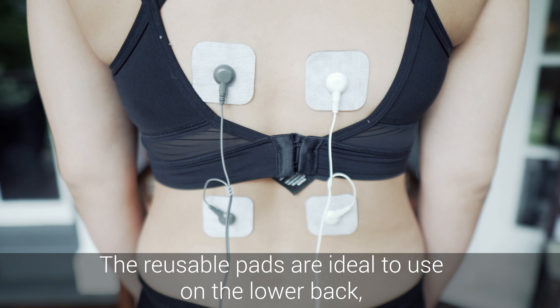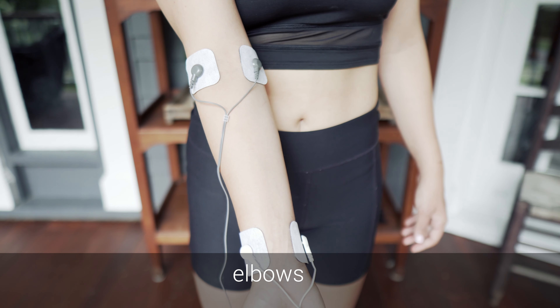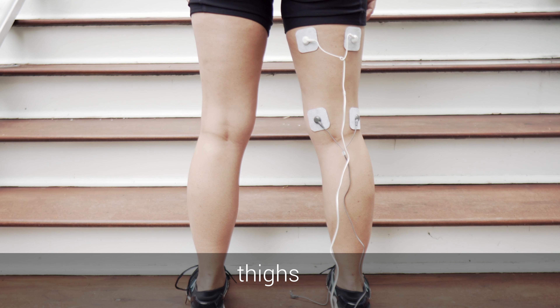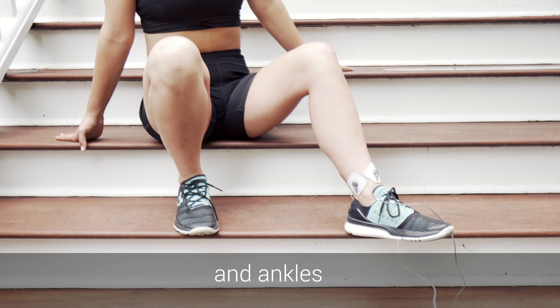The reusable pads are ideal to use on the lower back, shoulders, elbows, thighs, knees, calves, and ankles.